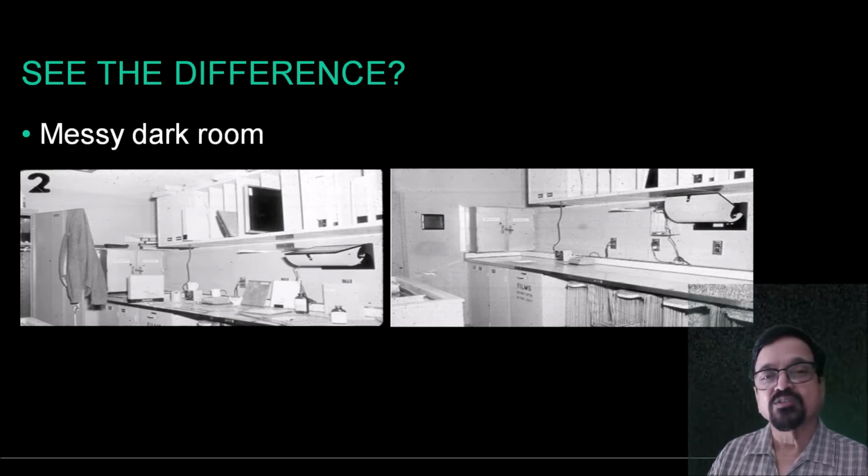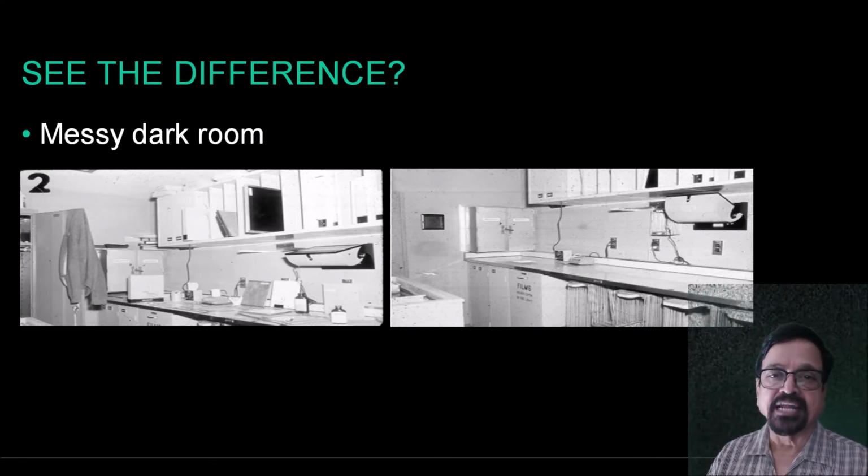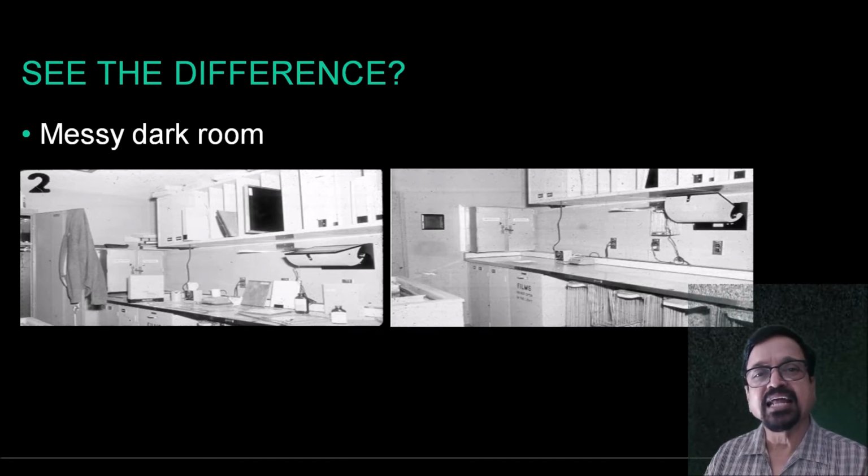It should be handy. Not only handy, a flowchart should properly be maintained. Like a cassette is drawn from the pass box, that is the exposed cassette. It is taken to the loading desk. On the loading desk, the cassette is opened. The film is taken out. It is put on the hangers, and a hanger is dipped into a chemical, that is, first the developer, second the rinser, then the fixer. It goes according to the time and as per specifications, and also depending on the temperature, because it's a chemical process which is very sensitive to the outside or surrounding temperature.